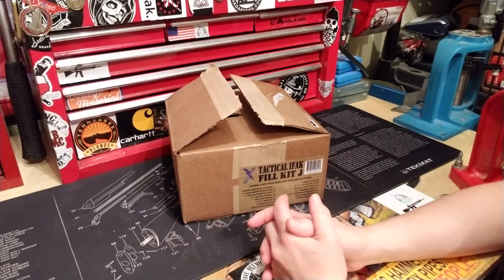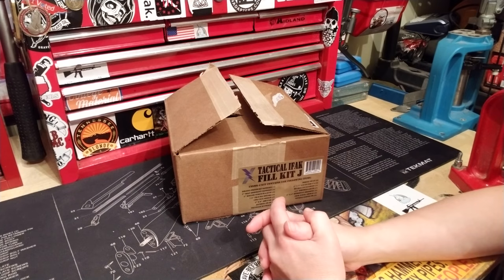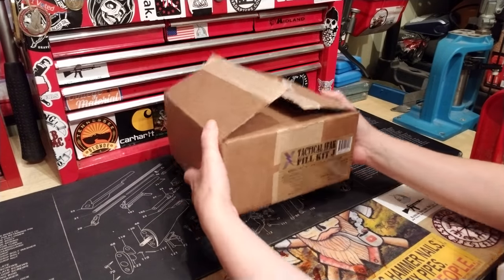This is the Tactical IFAK Feel Kit J. If you're interested in this kit, the link will be in the drop-down below. I picked this one up because I needed a kit for my Minuteman setup for my other vehicle. It's meant to show you a lightweight kit option.